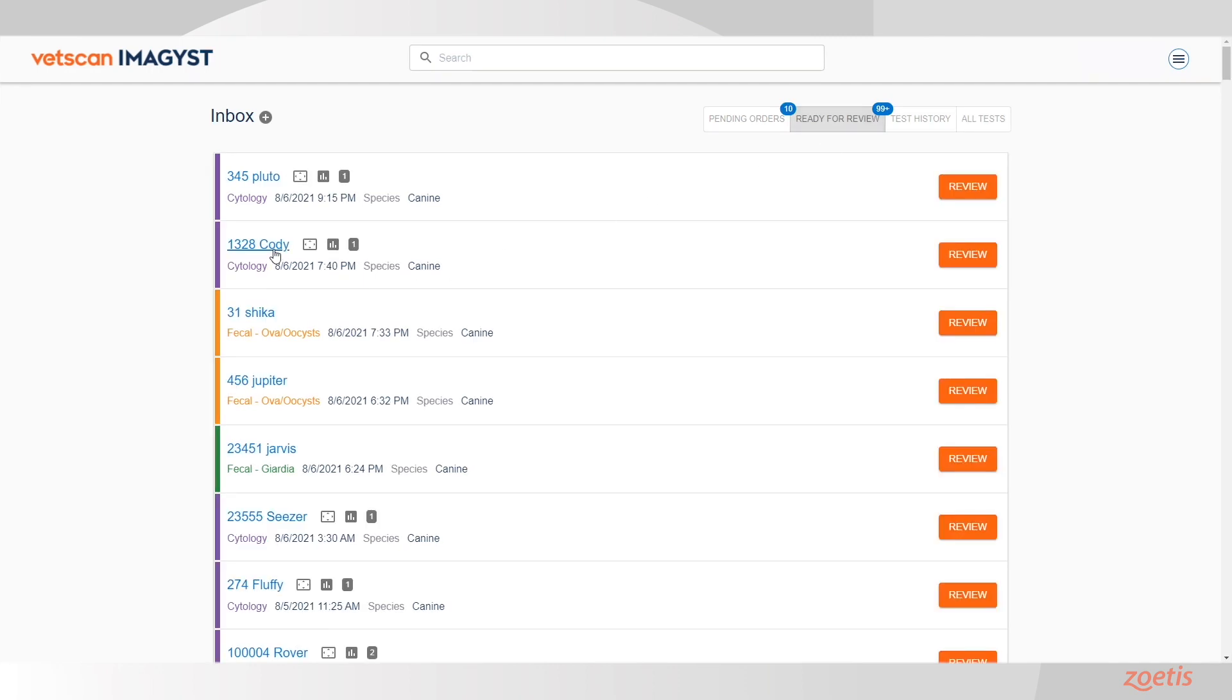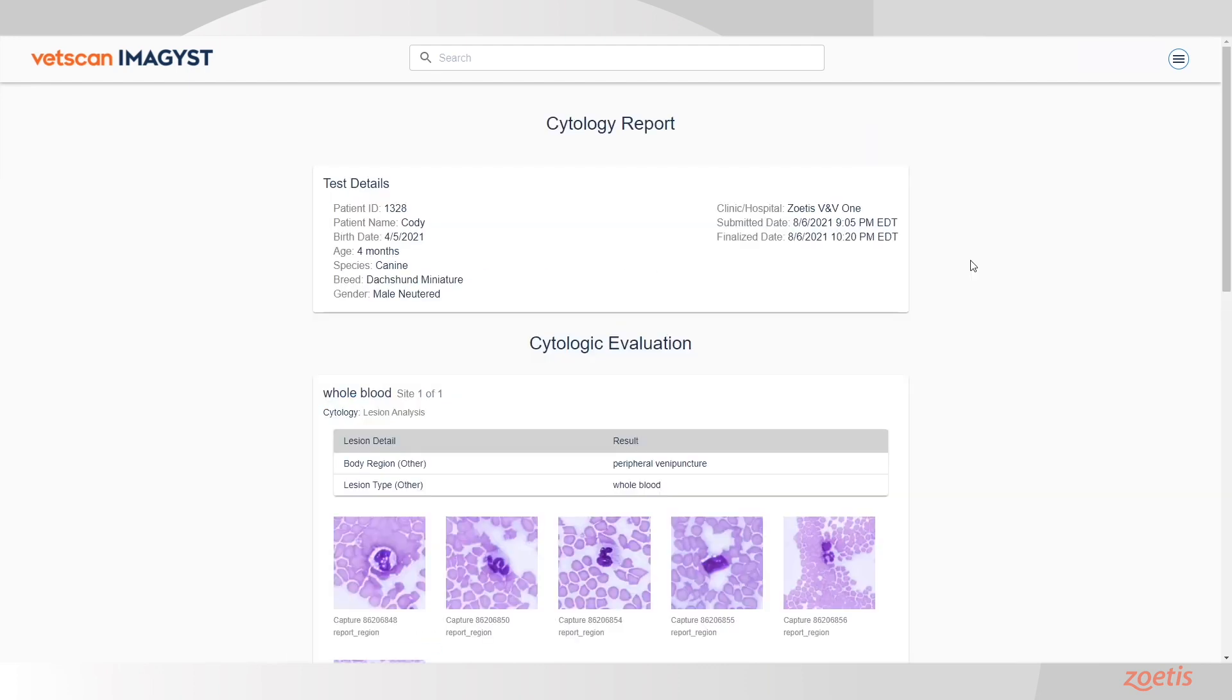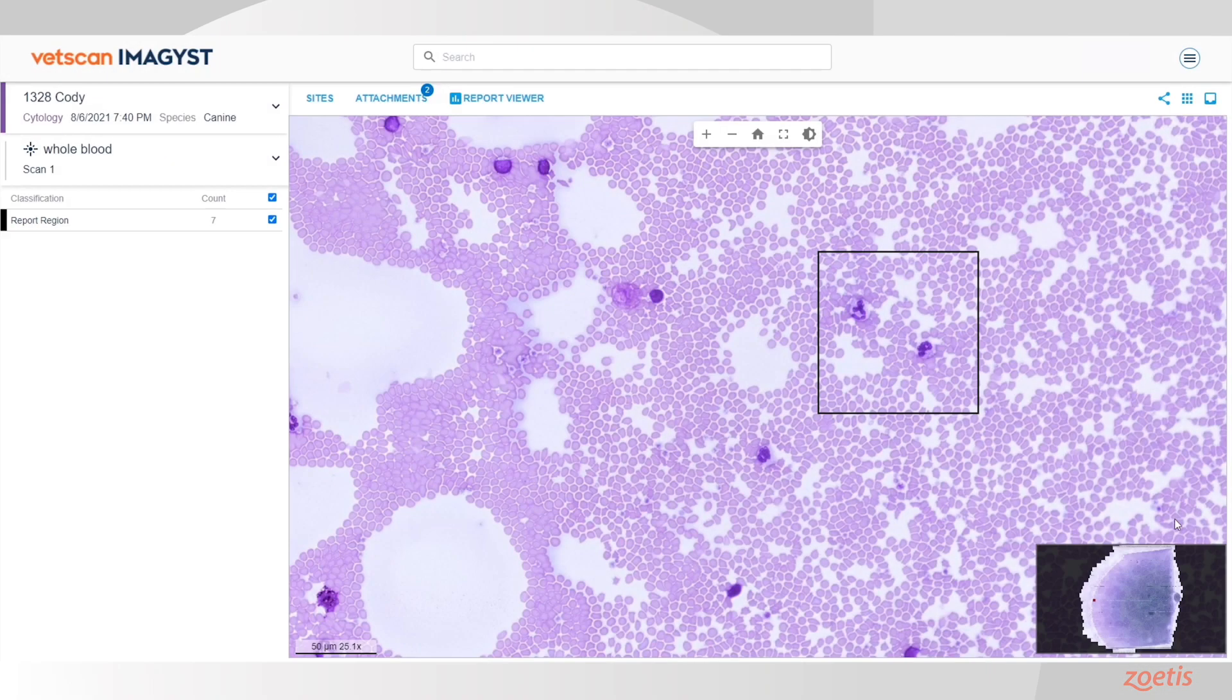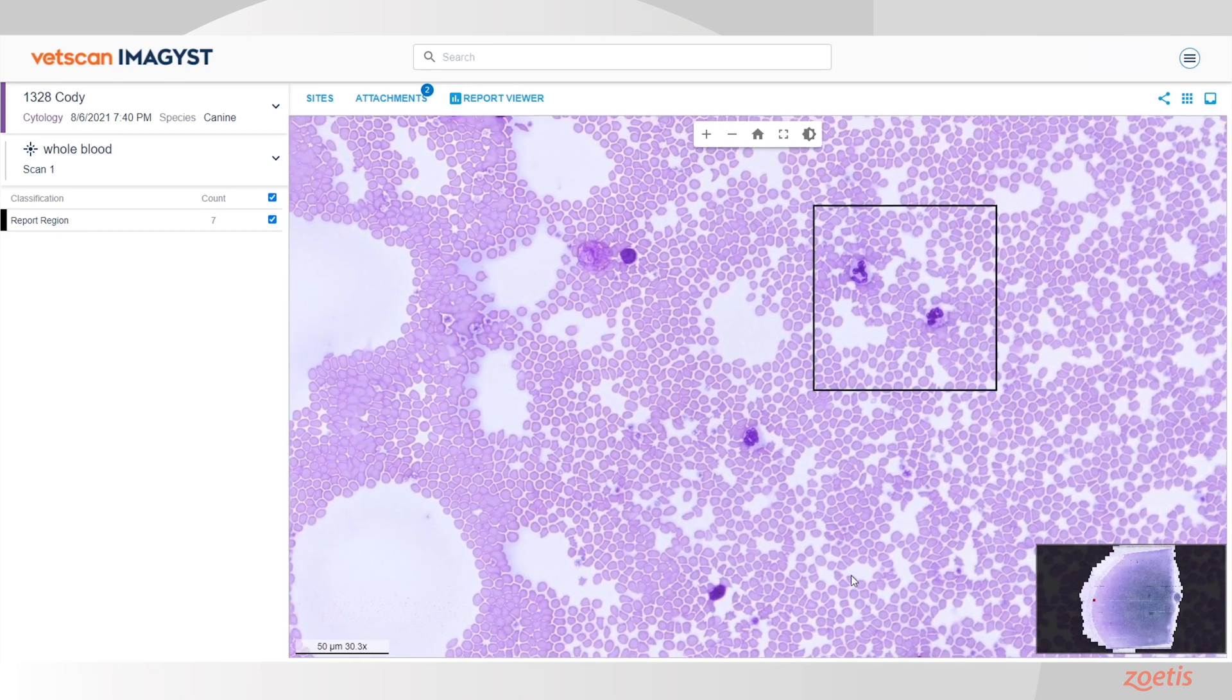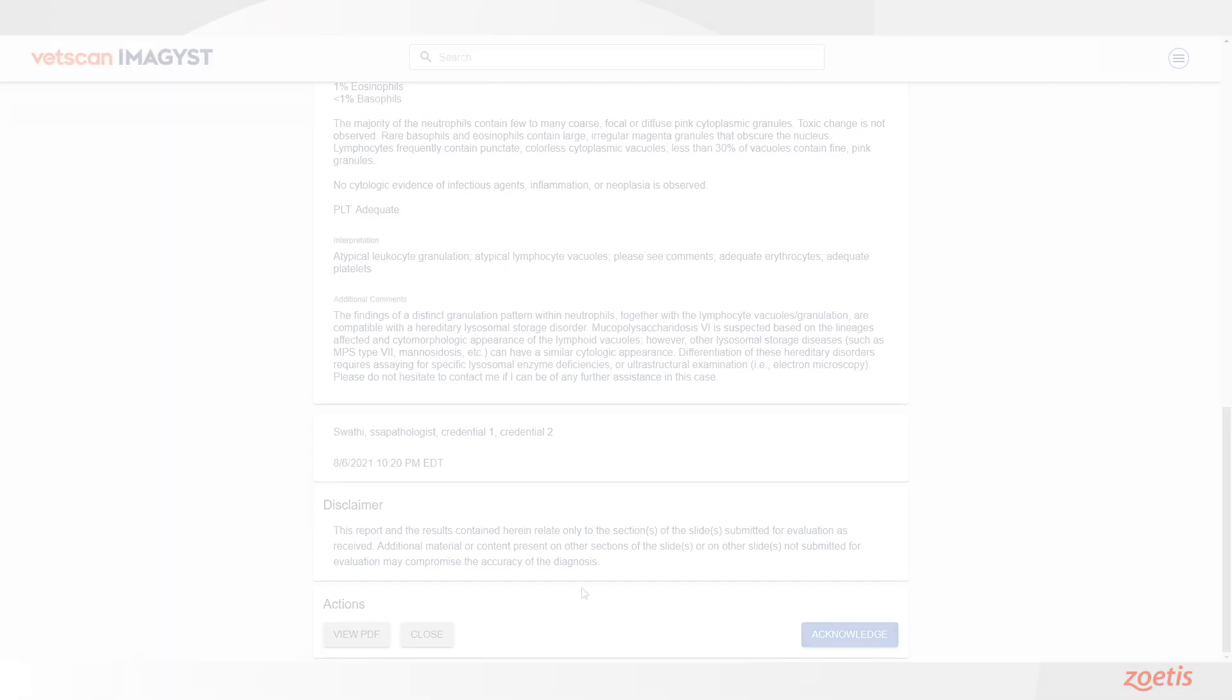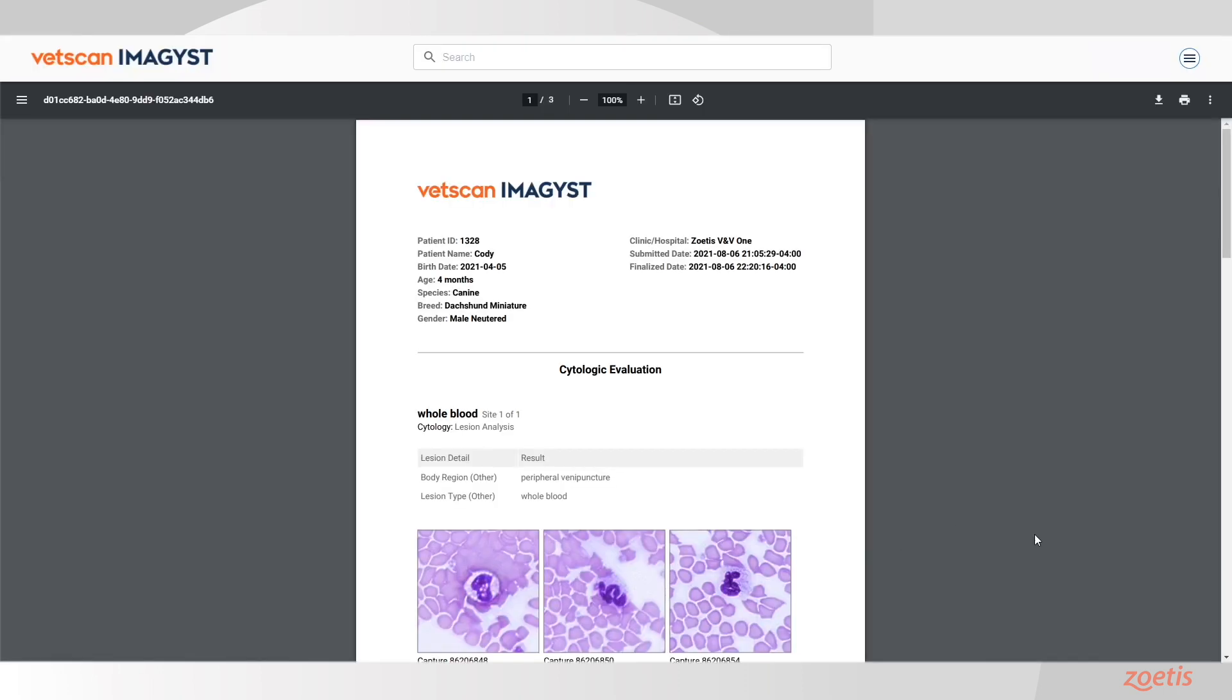If you find your specific test order and click on the Review button, the report will open in the Report Viewer. Anyone can review the results within VetScan Images with a shareable PDF report.